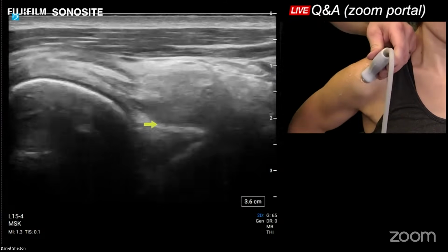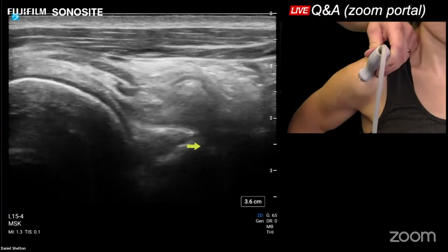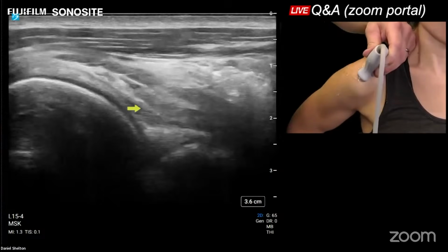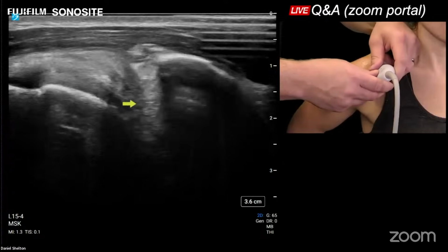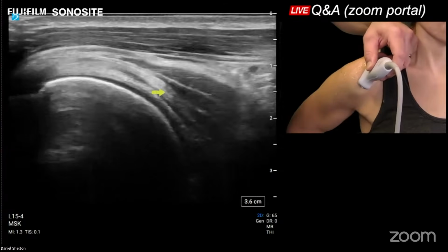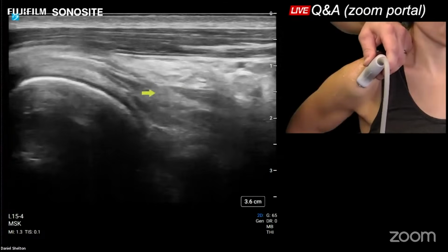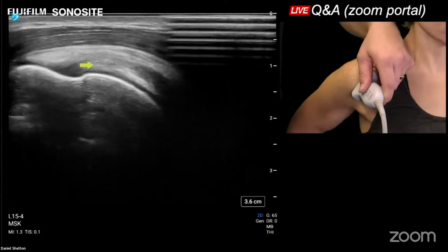And then we look for our proximal or most superior part of that glenoid tubercle for any biceps pathology that we can see there. And then proximal supraspinatus should be passing right through here. There we go. So that's the supraspinatus just before it starts to tuck under the acromion where we lose it. That's why we put our patient in that modified CRASP position. So long axis supraspinatus muscle here. And then I'm going to come on out to the enthesis.